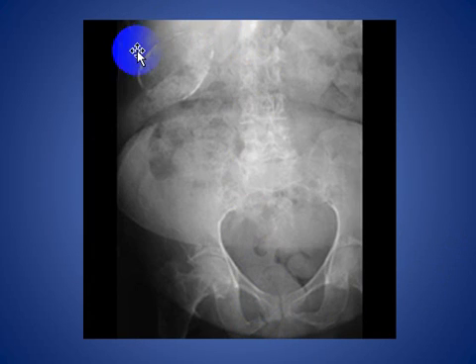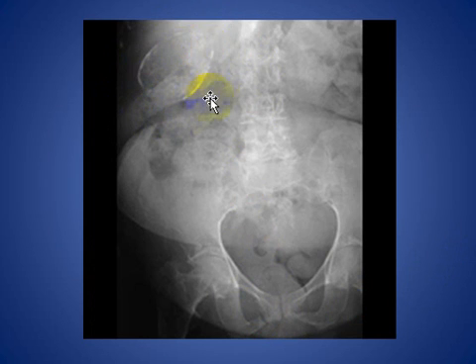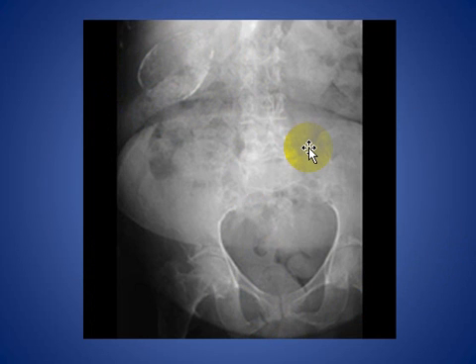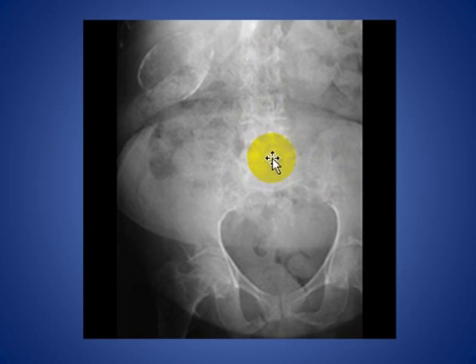Here you see calcification in the gallbladder wall. This is called porcelain gallbladder, and this is a pre-malignant condition. There are also degenerative disc disease changes involving the dorsal lumbar spine.